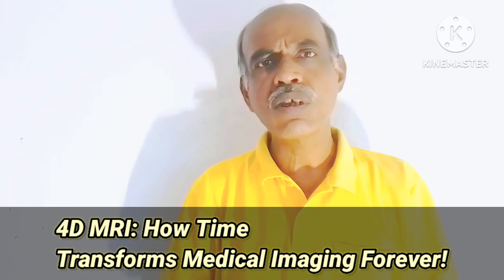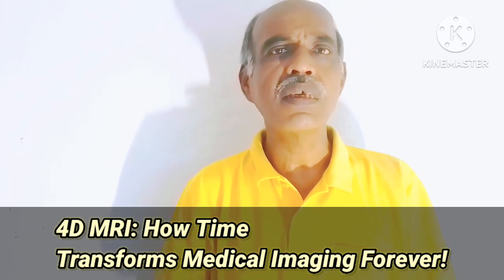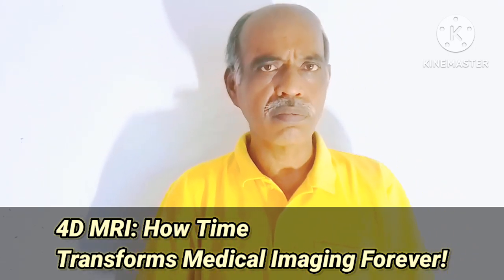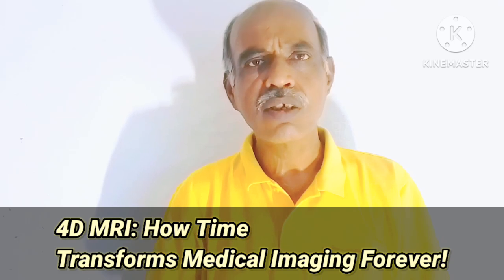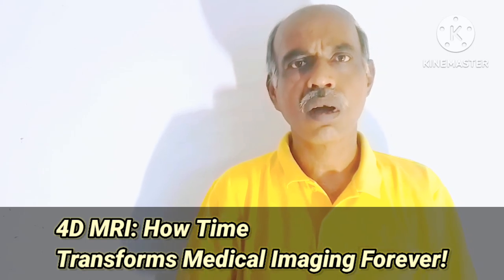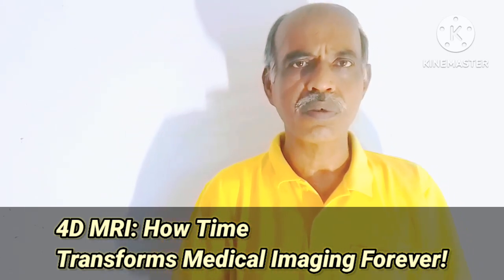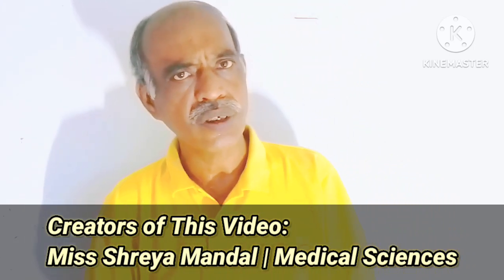That means what they actually want to see is dynamic images of the organs. Like in the case of oncology, that is tumors. In the case of pulmonology, that is lungs. And in the case of cardiology, that is the heart. Is this really possible? Yes, this is possible with the help of 4D MRI technology.